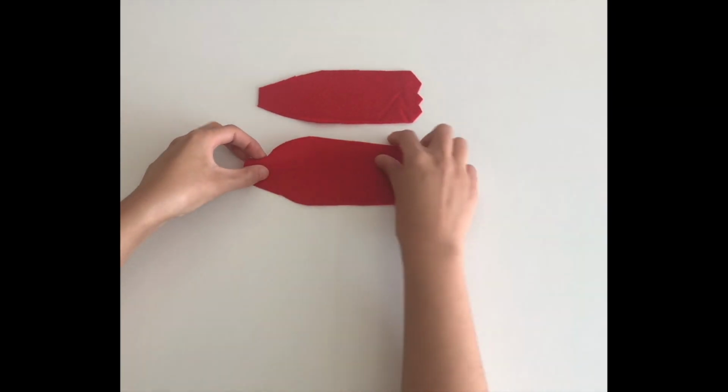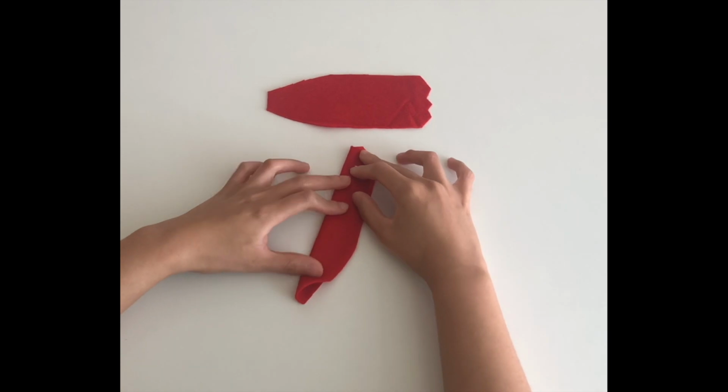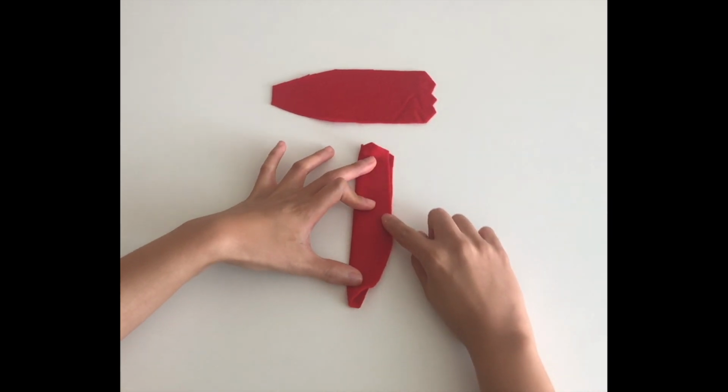Next, the fallopian tubes. Fold the shape in half and, keeping the fimbriae side open, sew along the sides of the tube.